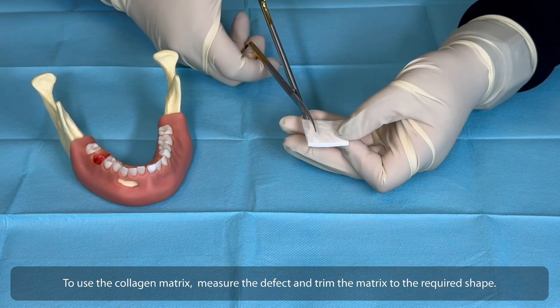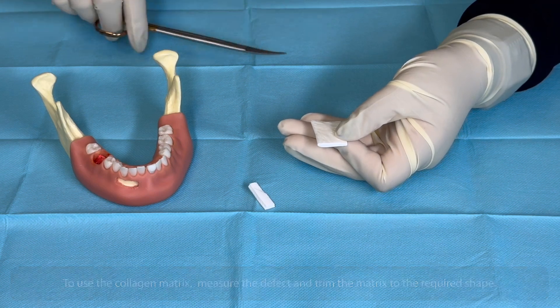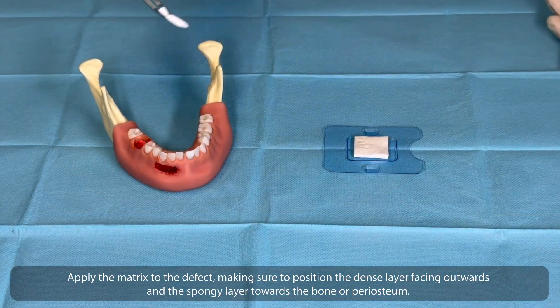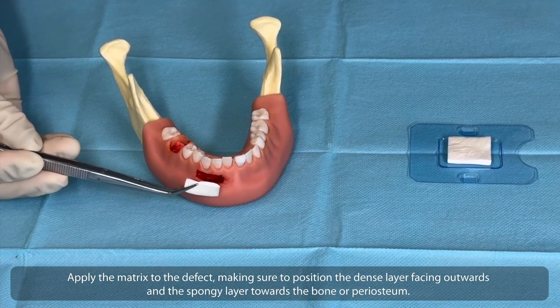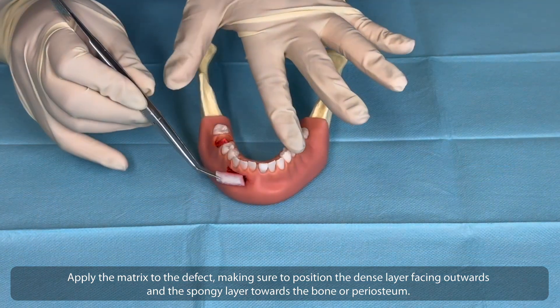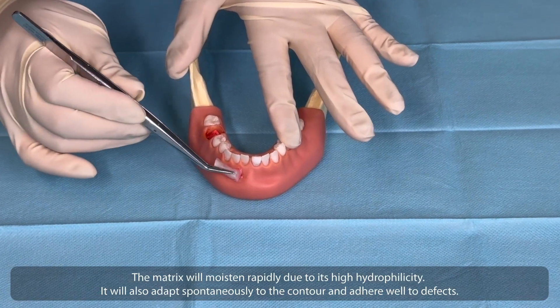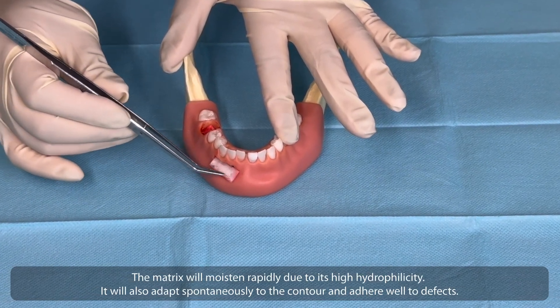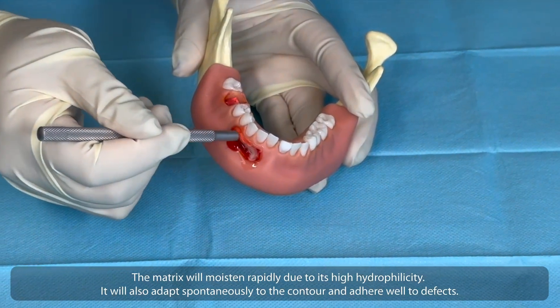To use the collagen matrix, measure the defect and trim the matrix to the required shape. Apply the matrix to the defect, making sure to position the dense layer facing outwards and the spongy layer towards the bone or periosteum. The matrix will moisten rapidly due to its high hydrophilicity, and will also adapt spontaneously to the contour and adhere well to defects.